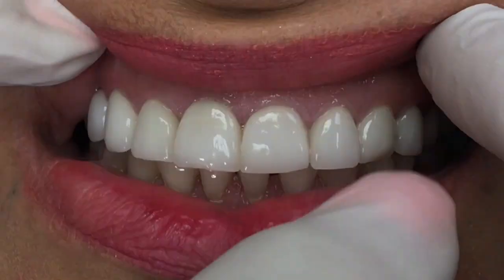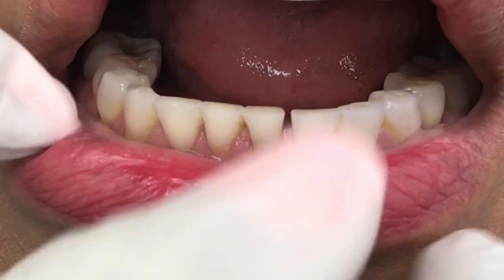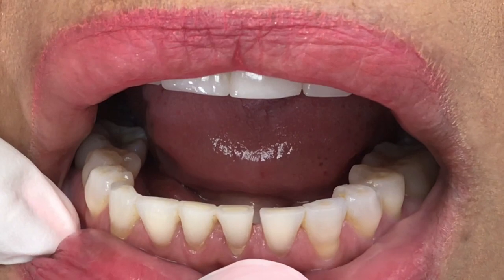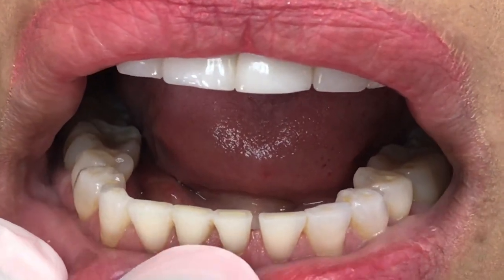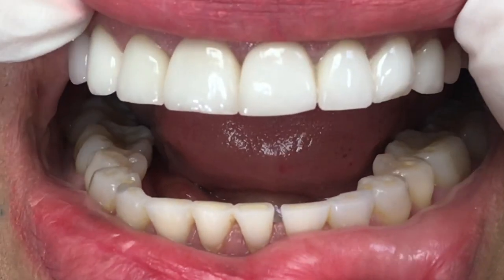The patient's got some beautiful veneers on her upper teeth, but go ahead and open. She did not like the color of her lowers and wanted to match the uppers. And let's just face it, veneers, lumineers are a little bit pricey. So there's no way we could whiten the teeth and get them the same color as the uppers. So we chose to do a lower Snap-on Smile to match your upper veneers.